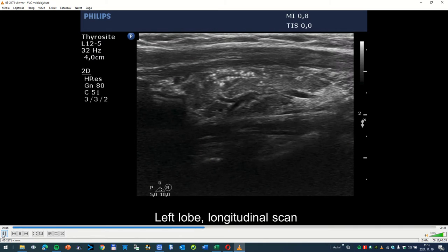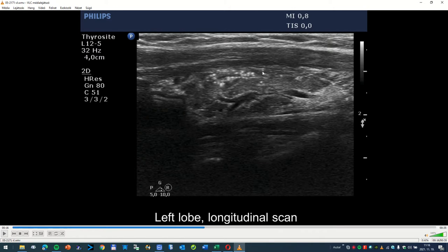It is very difficult to interpret these granules other than microcalcifications. It is a very suspicious pattern. Here we can see a possible core of a possible tumor, and scattered numbers of microcalcifications are found at quite a distance from this core. So this pattern raises the possibility of a multifocal papillary cancer.